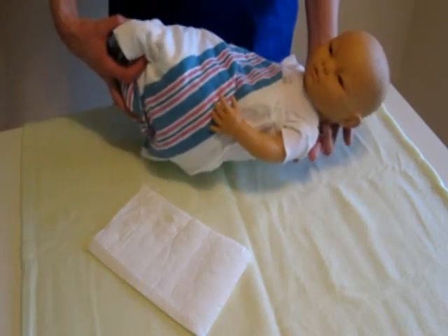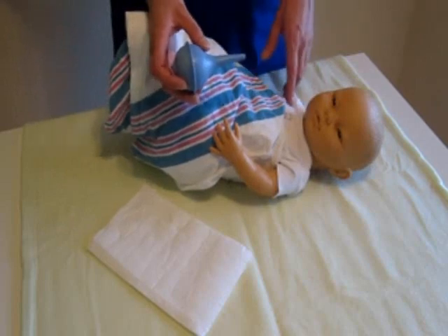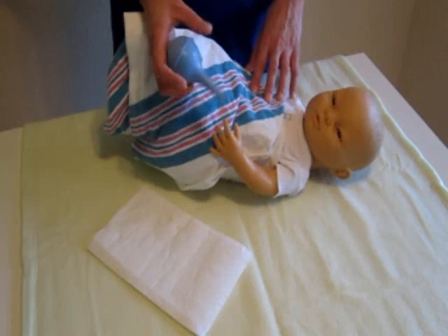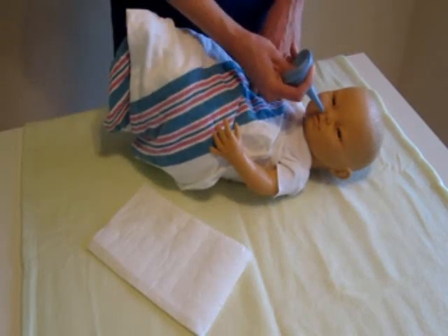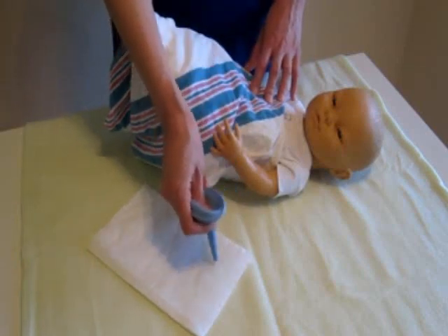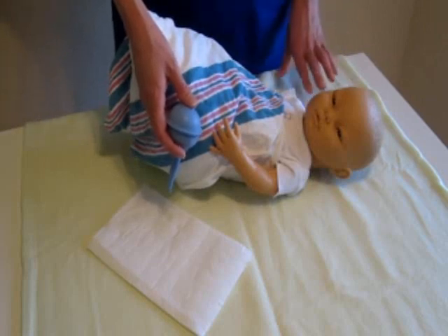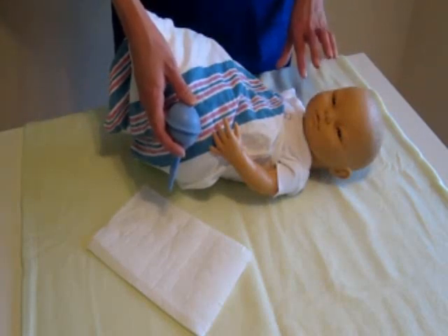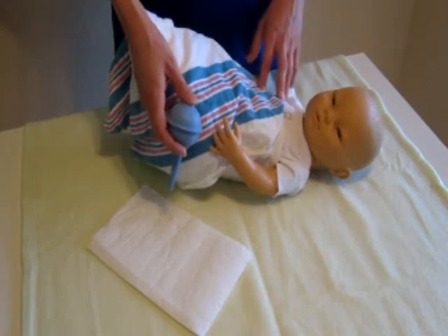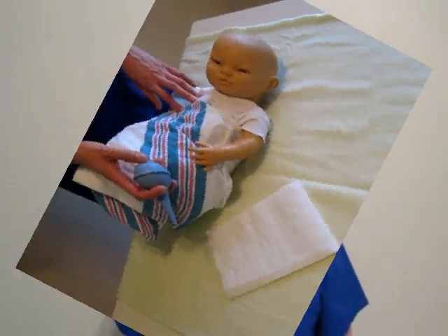Now, if your baby has a stuffy nose, you can also use your bulb syringe with some saline and just put a drop or two into one nostril and suction out the contents. Hopefully you get a nice big mucus, and then empty out the contents and do the same on the other side. Now, I don't advise doing this frequently because you can irritate the nostril and inflame inside the nares, causing even more congestion and stuffiness.